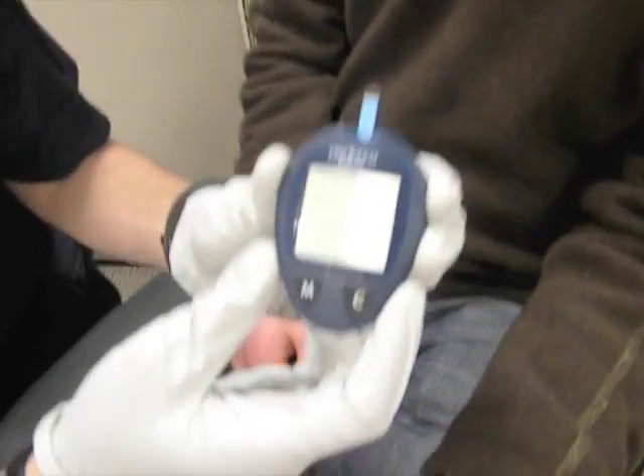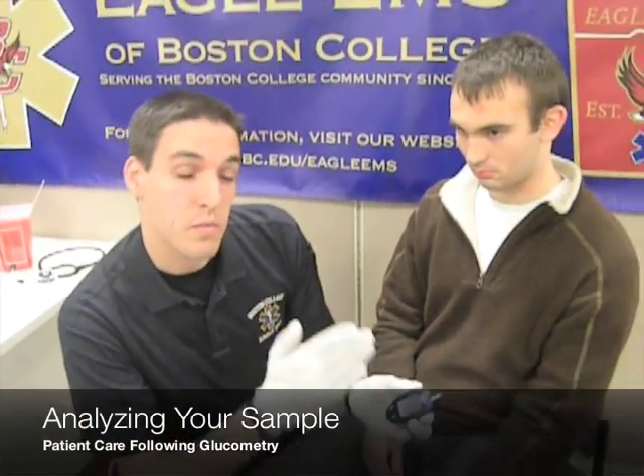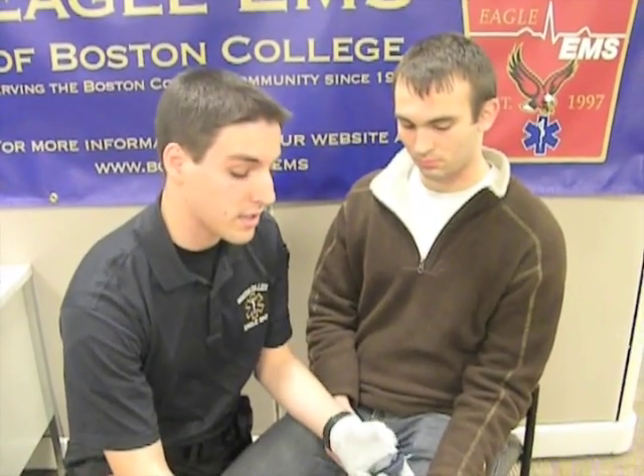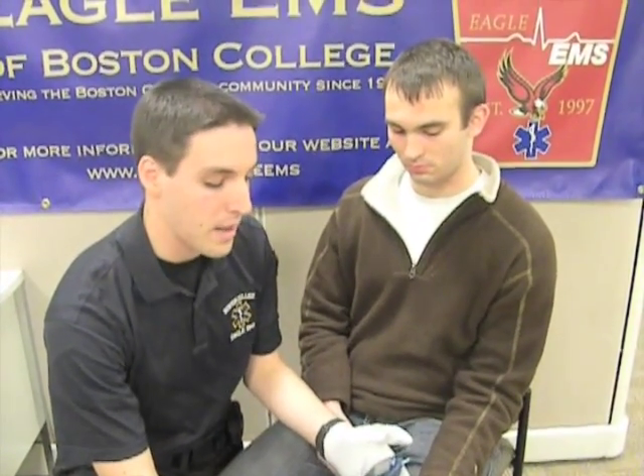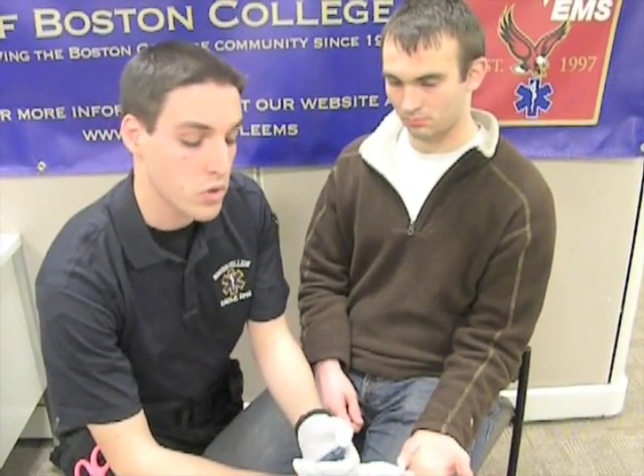It only takes about five seconds to get an accurate reading. Your normal blood glucose levels will be between 80 and 120, depending on when the person last ate. Anything less than 70 is considered hypoglycemic. And in the Massachusetts State Protocols, anything less than 70, you should probably be giving them some oral glucose.